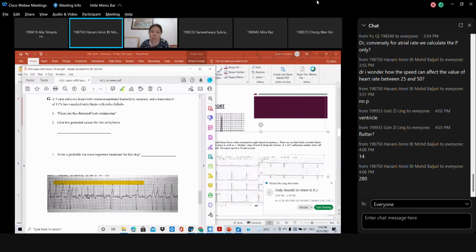Yes, doctor. So if it is ventricular beats, normally VPCs, ventricular tachycardia, ventricular flutter, ventricular fibrillation, this is what you get, high heart rates. The ECG trace, they will calculate the heart rate for you, then it will come up as everything which is going to be abnormal.